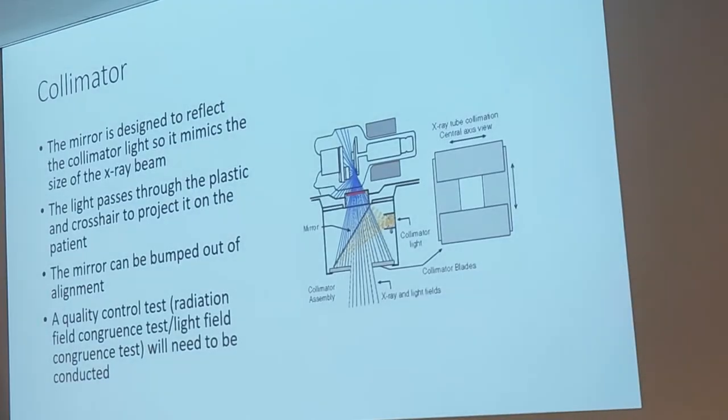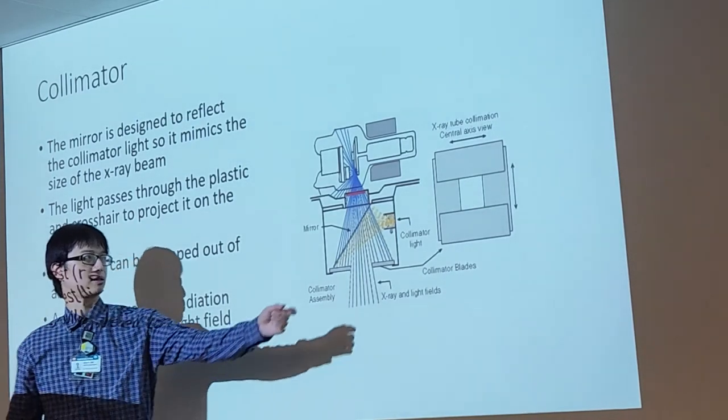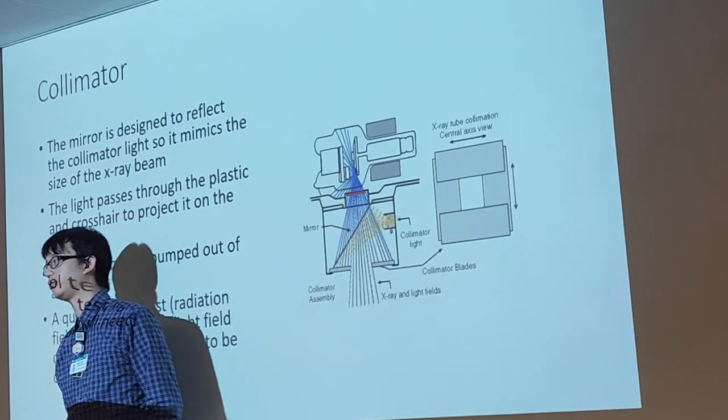Does that make sense? That's why the side of the tube is always kind of hot after we're done using it. Correct. That's why the side of the tube is hot, because that light bulb is right here on the side of your tube. Right?